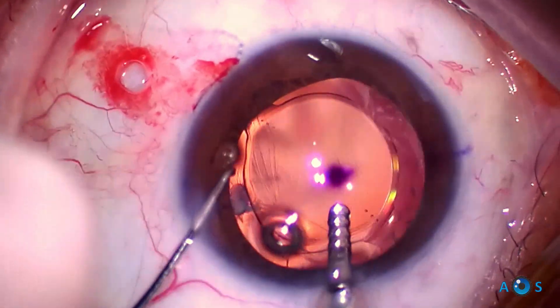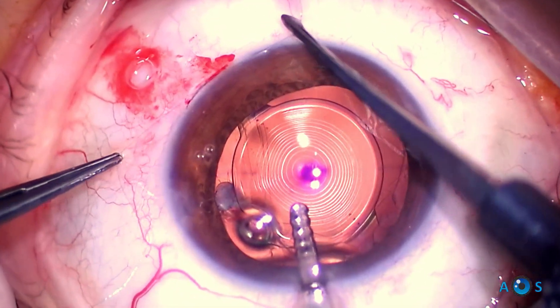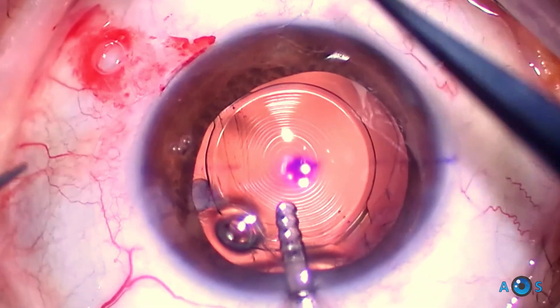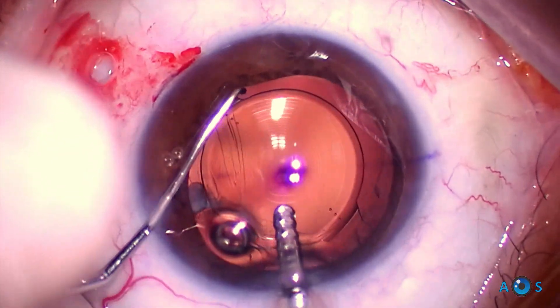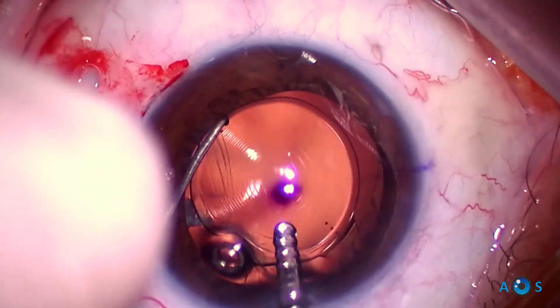Here is the second knot, which gives more stability to the scleral fixation. Again, IOL decentration is compensated by chopper maneuvers.